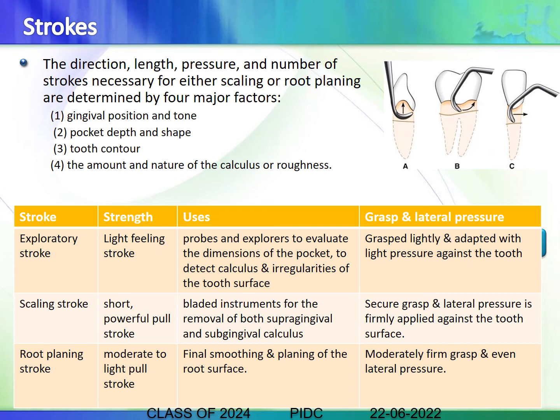Apart from that, you have directions of stroke, wherein the stroke may be applied in a vertical direction, in an oblique direction, or in a horizontal direction. Accordingly, the names given are oblique, vertical, and horizontal strokes.